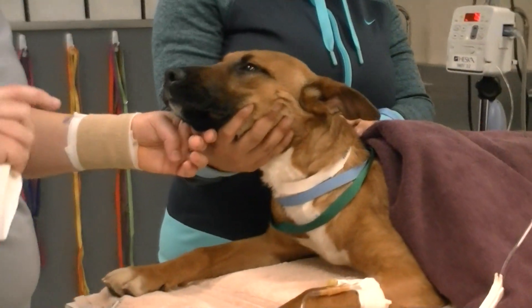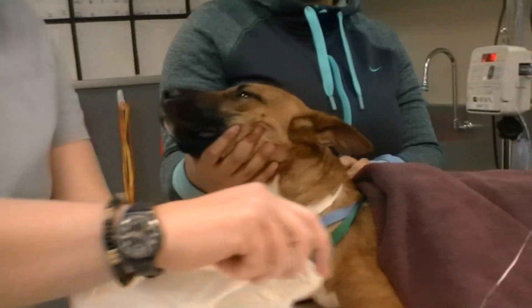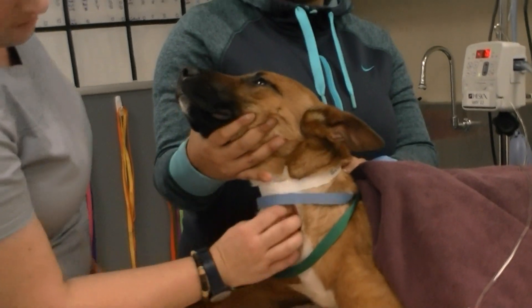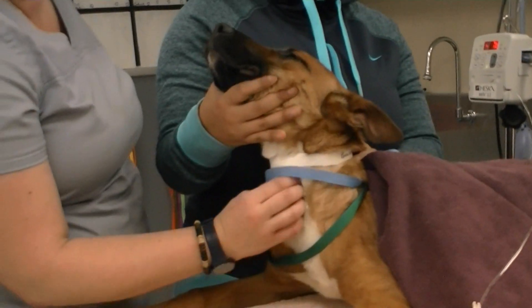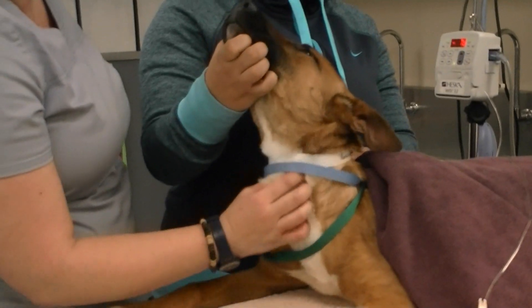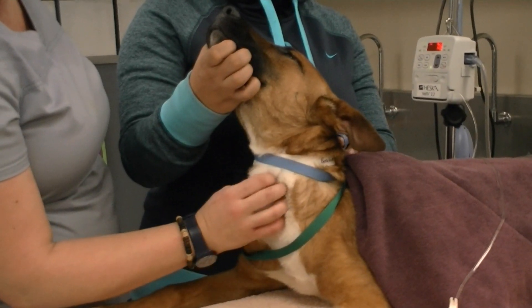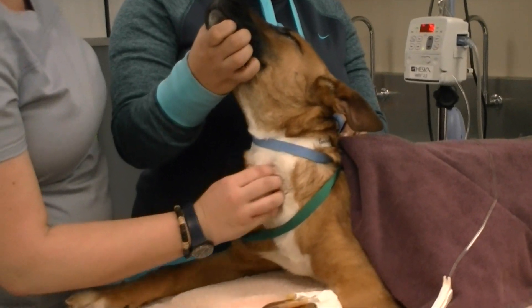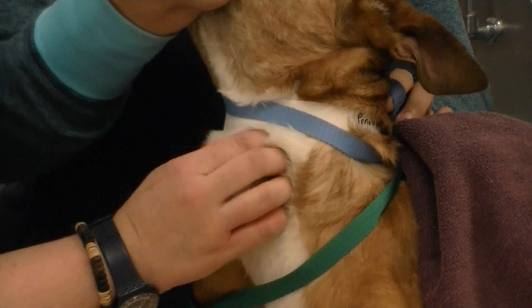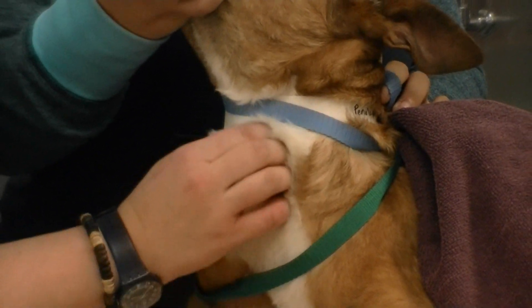A better way, after getting an idea with that, is to actually palpate the trachea. I'm going to find the big boxy structure on her throat — that's the larynx. I don't want to use that to measure because it's much bigger than her actual trachea, but it's easy to find. Once you find that, just drop your fingers caudally and you'll feel the rings of the trachea. I think an eight is a good fit — we may even be able to do an eight and a half, but we'll start with an eight.